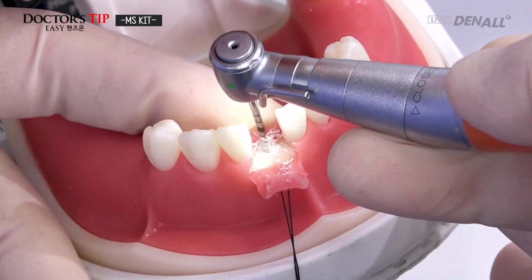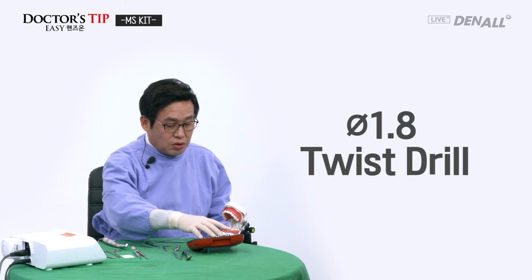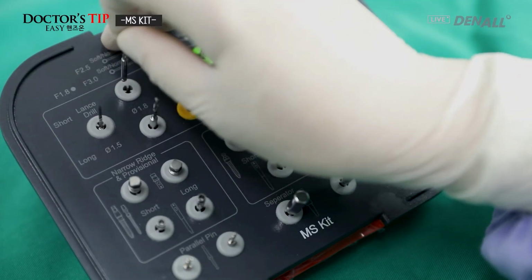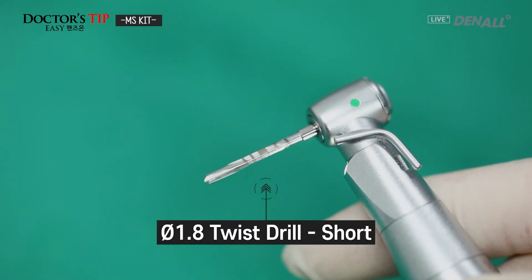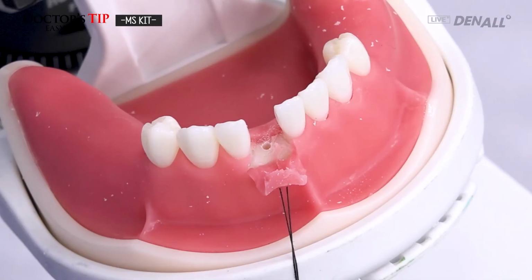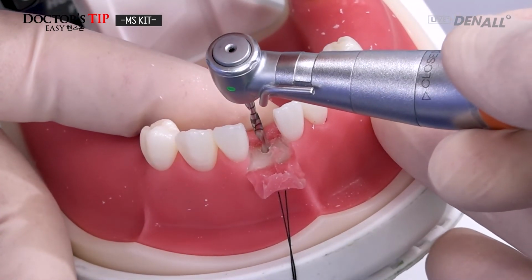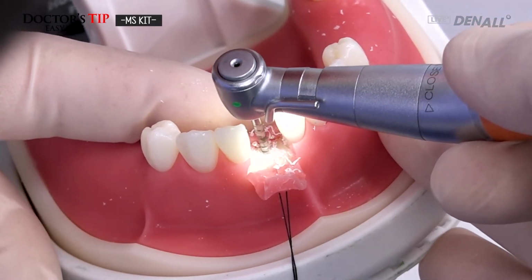put a hole in the cortical bone with the 1.8 diameter twist drill. You have short and long versions. I will use the short for my first drilling. So a 1.8 twist drill like this. RPM I changed to 1200, and as you can see, in the area I placed, I position it, and the diameter 1.8 twist drill is used.